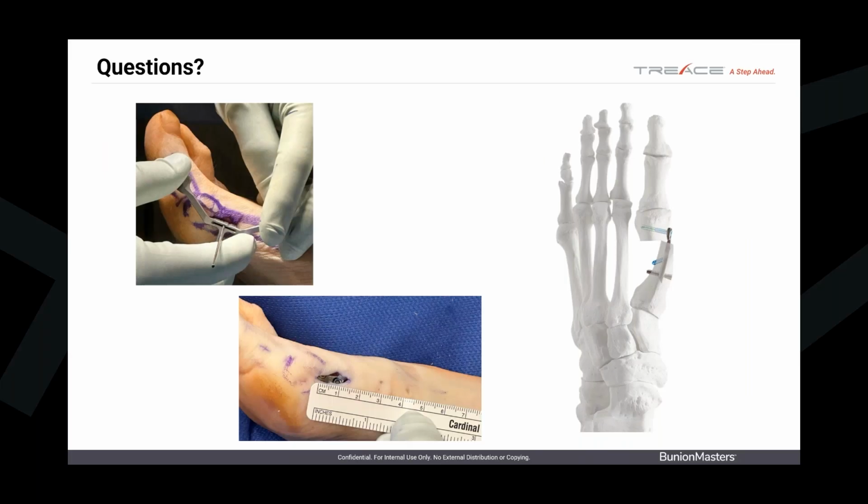The more lateral you are, the less your two screws in the shaft will come close to each other, and the larger amount of bridge between your angled screw and your osteotomy. So I always prefer my plate standing up as much as possible, almost perpendicular to my osteotomy. That gives it its best strength. That makes sure that the screws are angled into the distal head and away from my osteotomy. I just like to stand that plate up. So I use the control knob to dial my plate into position. That's one of the most important things I do. And then I check the lateral to make sure that it's in perfect lateral alignment.